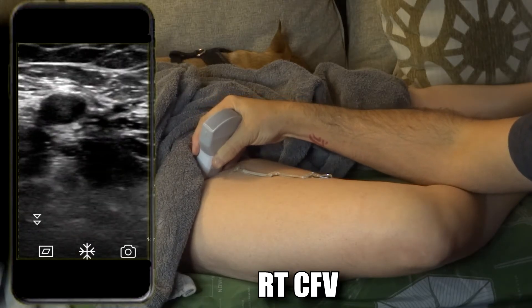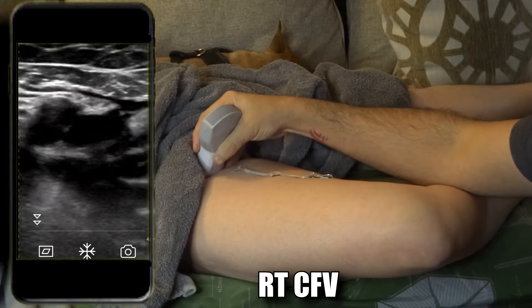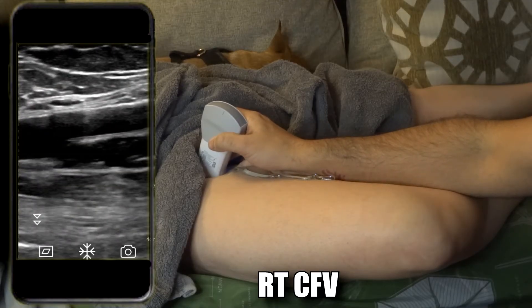Compress, freeze, take the picture, unfreeze. Go into sagittal — here you can see the bifurcation of the common femoral artery into superficial and deep.